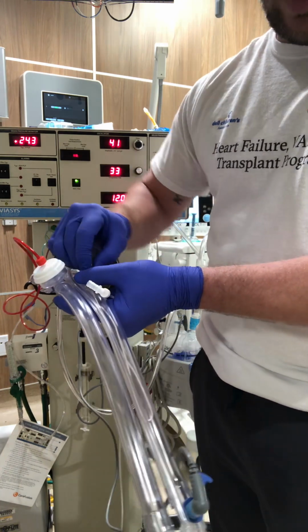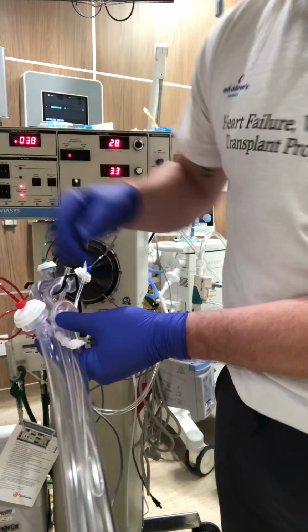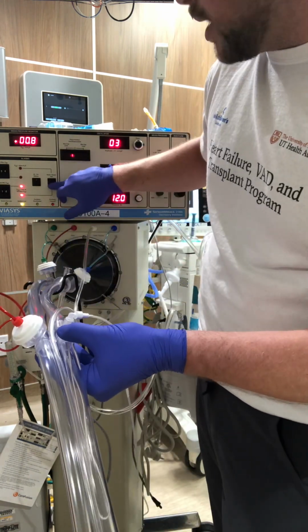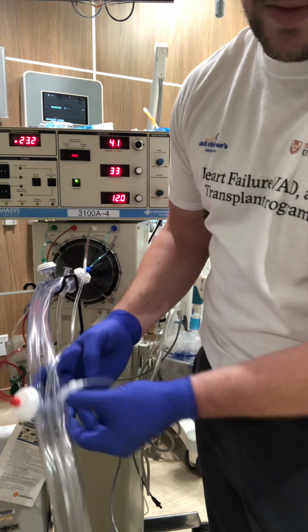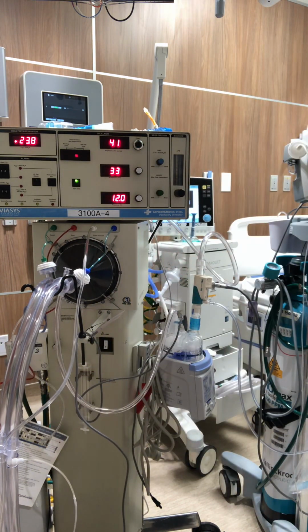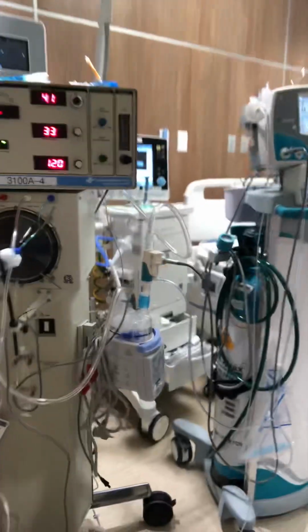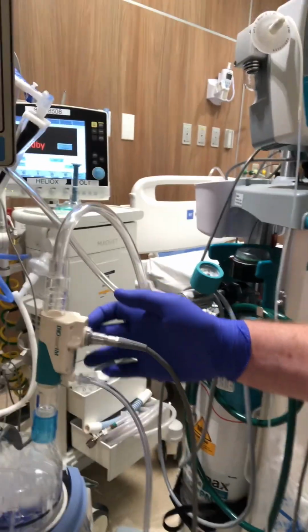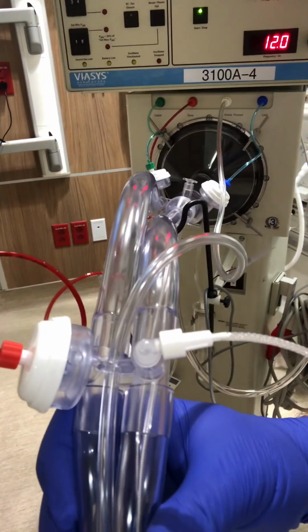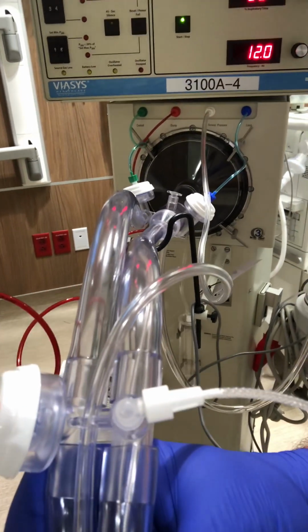So cap off, oscillator shut off. I'm adding my sample line, holding that reset power fail. My oscillator is back on, running with the same settings that we had before. So now we're delivering nitric through our module on the dry side of the heater, and then we're sampling nitric from the circuit across from the red mushroom cap, that port right there.